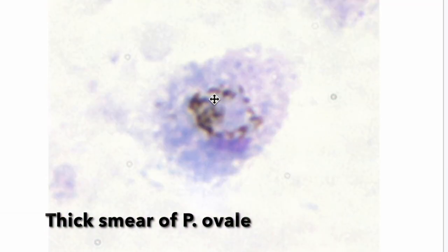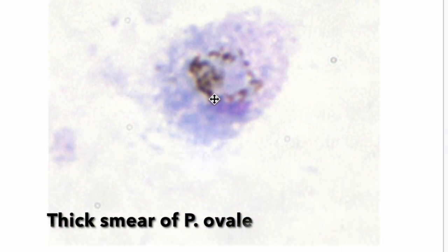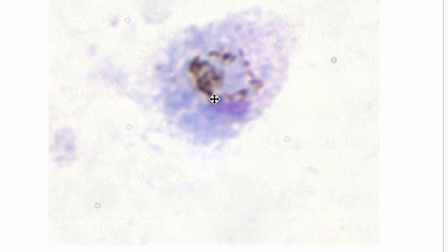And here's another gametocyte in a thick smear. There's no way I would have picked that up as a gametocyte, but I'm new to this, so people that are experienced will be able to pick it. Be strong.